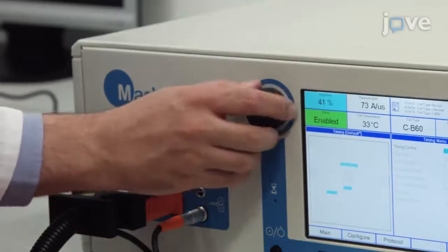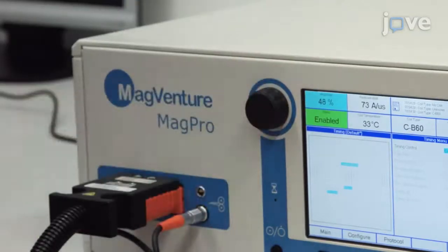We also use EEG synchronized TMS to investigate the basic neurophysiology of brain oscillations in the human by comparing the effects that stimuli have, which are identical but are applied during different brain states. The effects can be subtle and are easily washed out by other sources of experimental variability. We found that low stimulus intensity works best to observe the effect of sensory motor rhythm on corticospinal excitability.